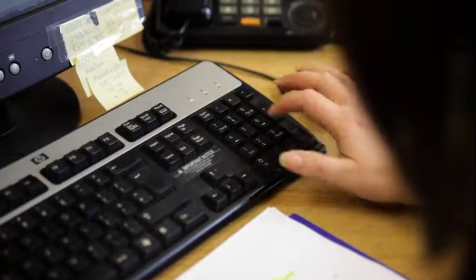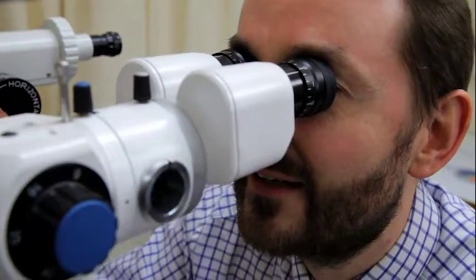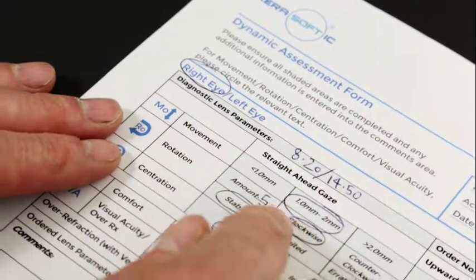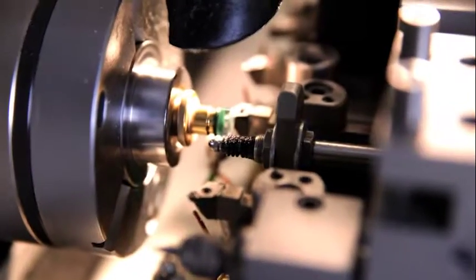If a customised SMC design is required, a trial SMC diagnostic lens can be designed with our lab customer services. They will take into account the topography, information about the corneal shape, and details of the best performing standard diagnostic lens to design an appropriate diagnostic lens.